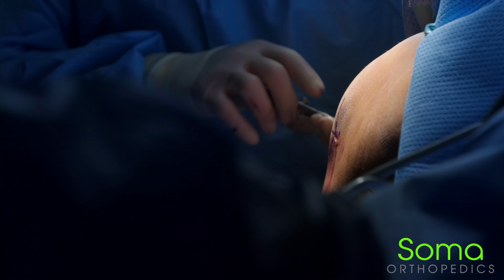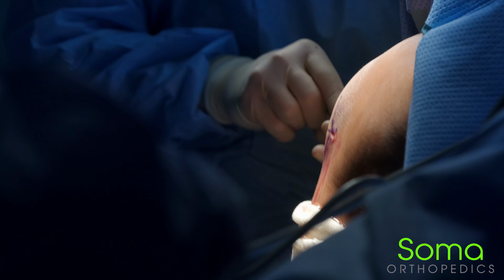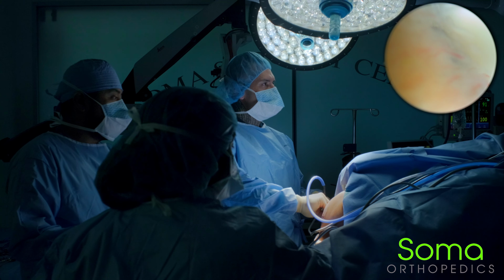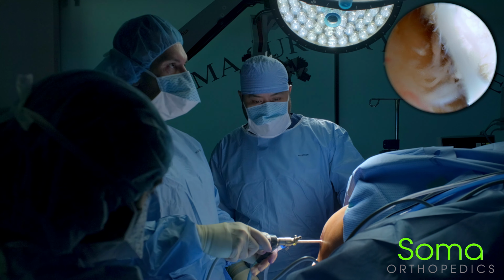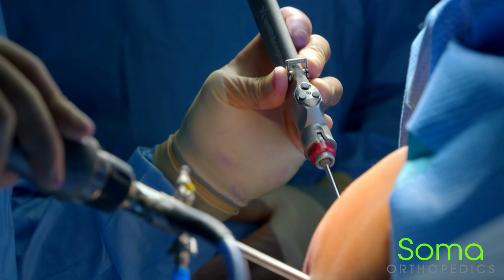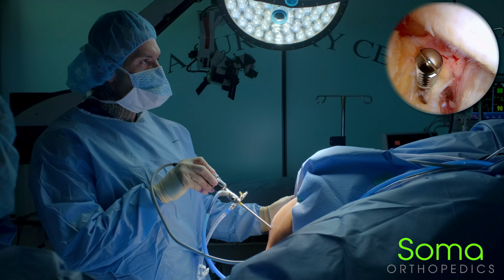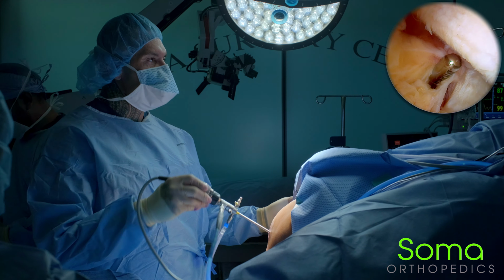In this procedure, we went in and found the tear in the meniscus. It was a small tear, and we cleaned up the edges with what we call shavers, which allows us to return the meniscus back to a somewhat normal anatomical structure. What this eventually does is help the patient in terms of their pain. It reduces clicking or popping sensations and just overall improves the patient's symptoms and function.